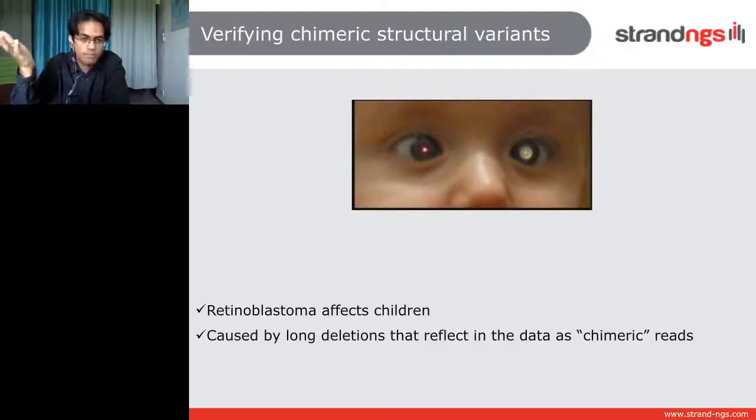And let us say one of the parents, let's say the dad, contained a germline mutation that caused retinoblastoma in him as a child. And he's worried about whether his children are prone to it or will get it, right? So he wants to know if he's passed on retinoblastoma through the germline to his children. And this is a very reasonable question to ask, and it's a very reasonable question for which a genetic test could be performed, right?